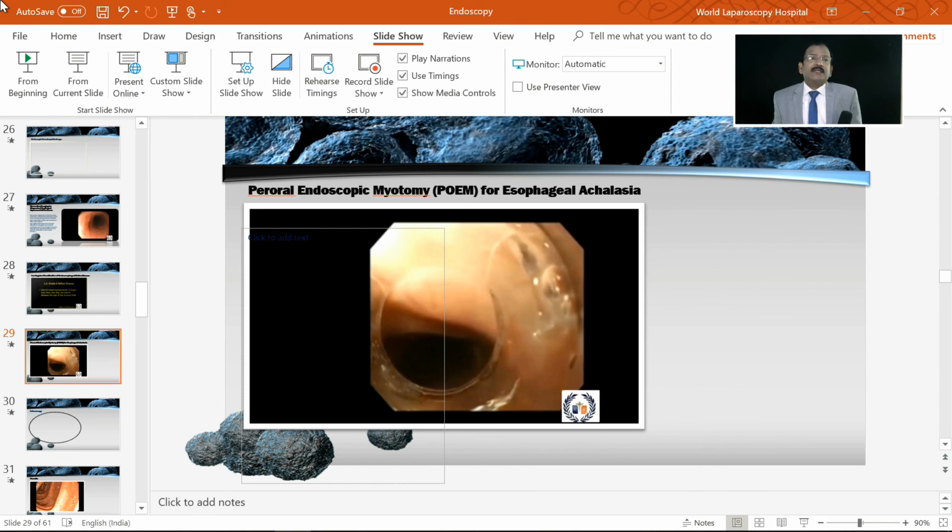But here what is the advantage? This is chip on tip technology. CCD, which is in the head of the camera, is at the end of the endoscope. So there is no lens ahead, so you don't need focusing. Focusing is not required. Just like your mobile camera, there is no lens in front, so you don't need focusing. But an SLR camera needs focusing. So exactly the same way it is not required. White balancing has to be done.